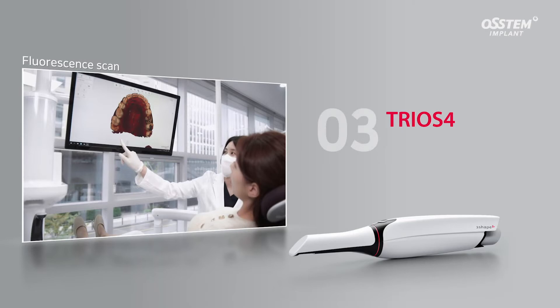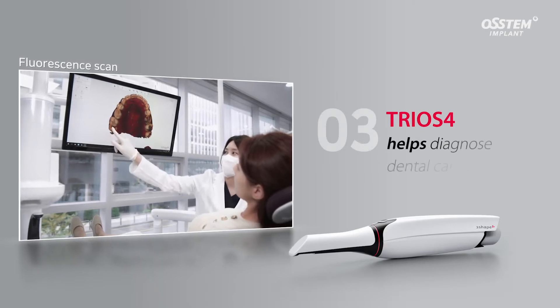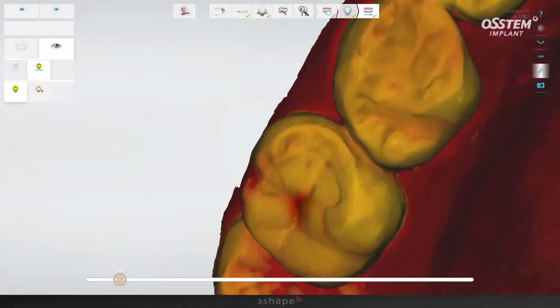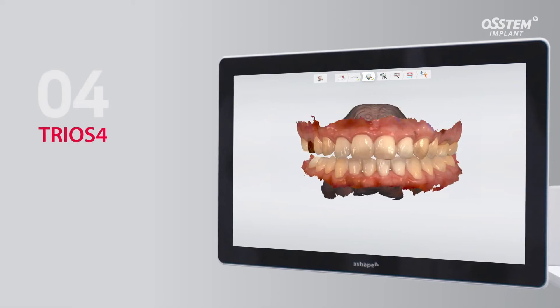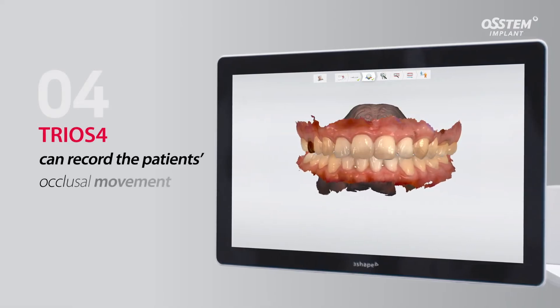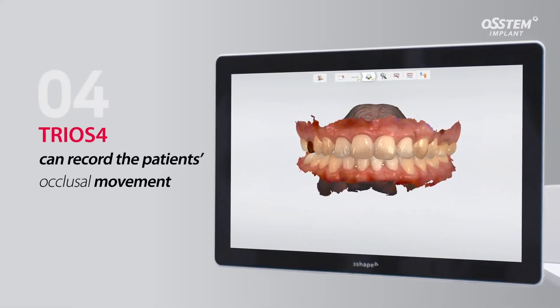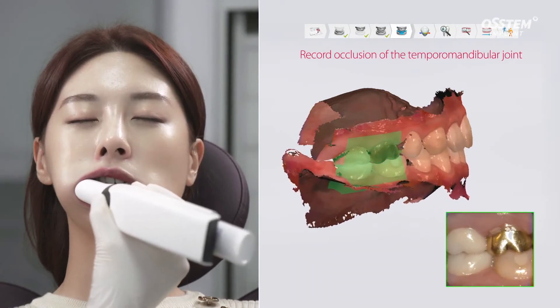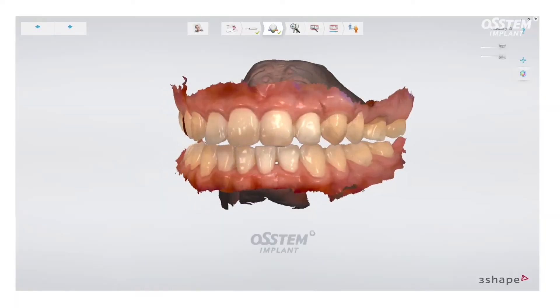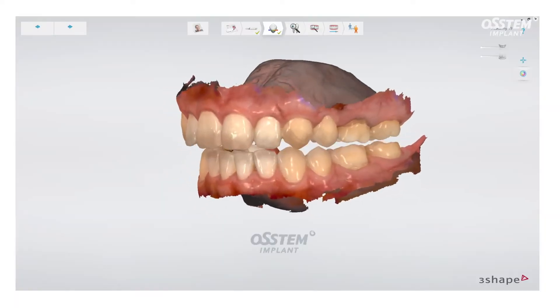The TRIOS 4 helps diagnose dental caries with its fluorescence scanning function. Clinicians can also track changes in dental caries over time. The TRIOS 4 can record the patient's occlusal movement, and the patient-specific motion function allows clinicians to record occlusion according to the movement of the patient's temporomandibular joint.